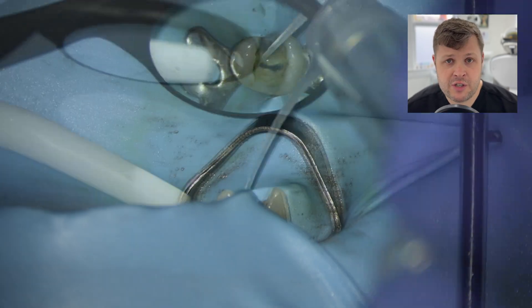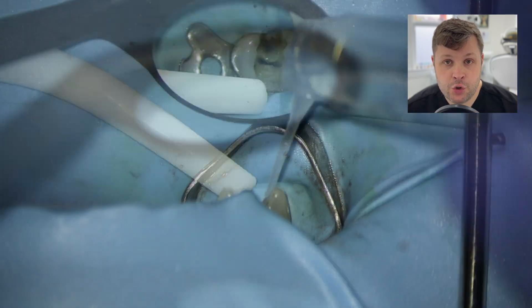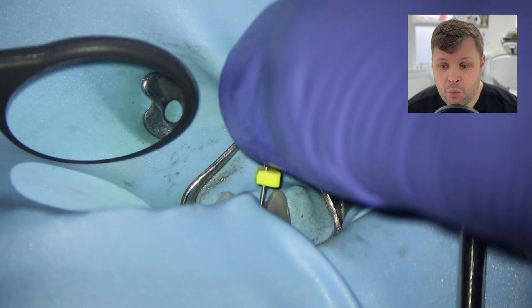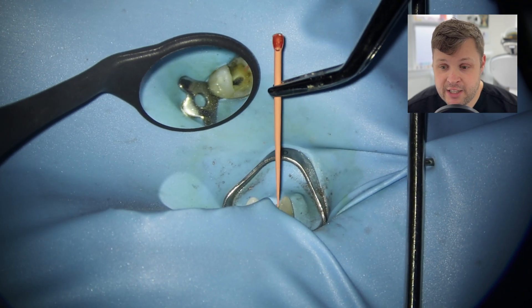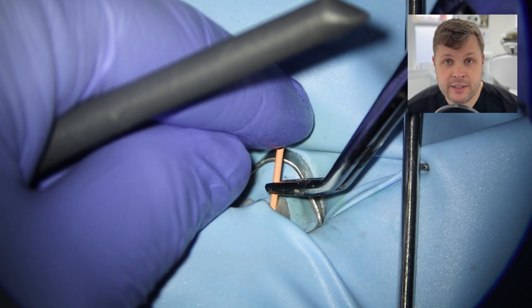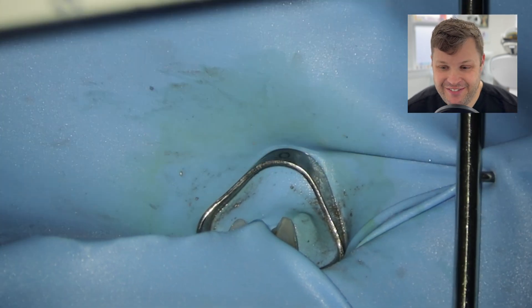That's the buccal canal fully shaped. We know the palatal joins onto the buccal, so we need to ask at what point does it join. I fit a GP point into the buccal canal to check — but it doesn't fit nicely to length, meaning it hasn't been shaped accurately. I decide to focus on one canal at a time rather than flipping between the two, which makes it confusing. I'm going to re-irrigate the buccal and reshape.